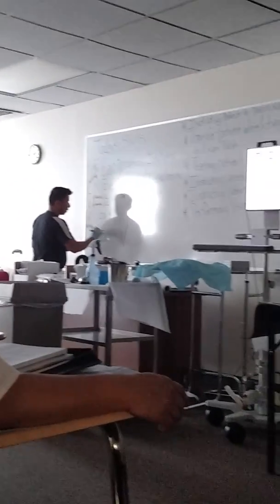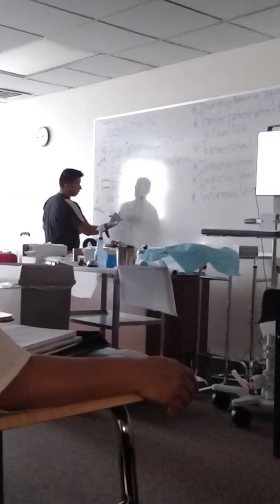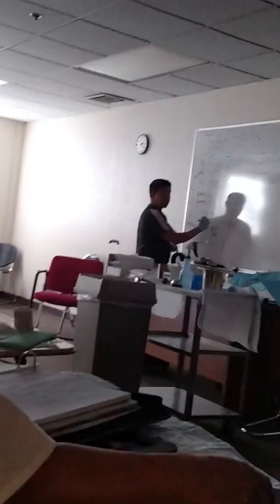L V C Z O T E P. Okay. So without the glasses, what was his reading earlier? 20/60, right? Now with the glasses, I'm going to put here what? 20/15 or 20/20, with the pinholes.